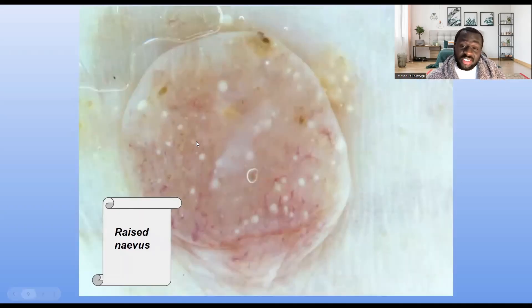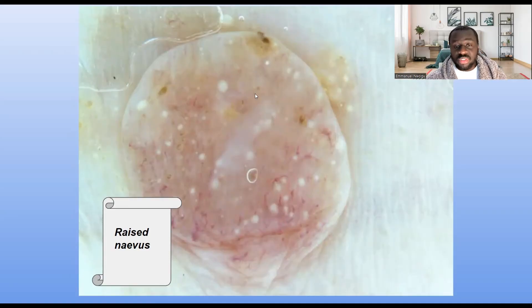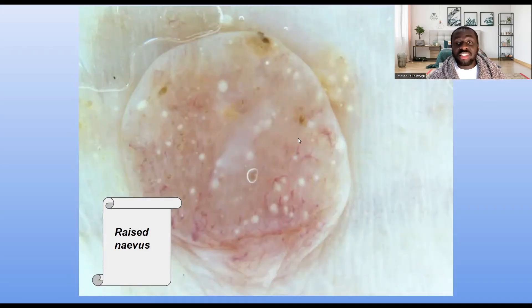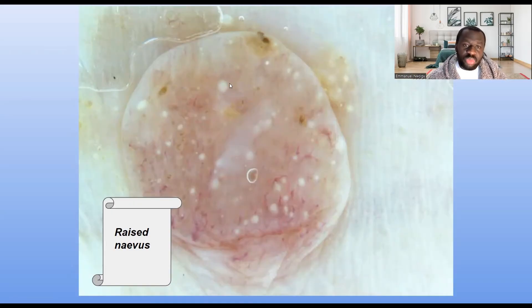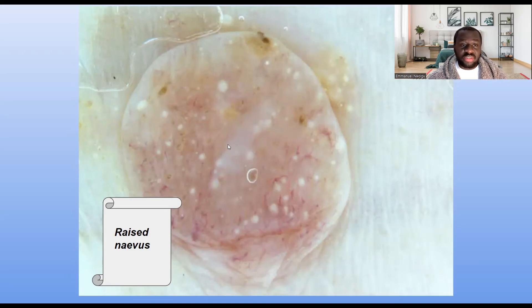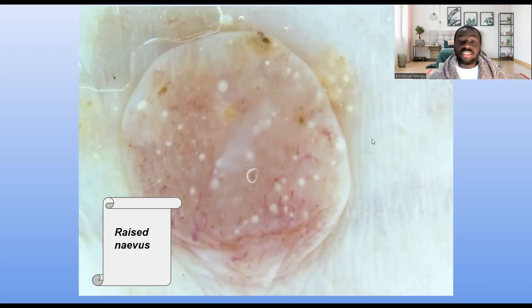This is also a benign melanocytic nevus, but it's a raised nevus. Most nevi would be flat — a flat pigmented lesion — but sometimes you could have a nevus that looks like a sessile polyp with a broad base. When you run your dermoscope on that nevus, you're going to see that it rose on your dermoscope. Some people classify this as a sessile skin tag. The most important thing is that when you look at this lesion, there's nothing that appears malignant — no arborizing blood vessels, uniform vasculature around it. You could describe this as a raised nevus or a sessile skin tag.